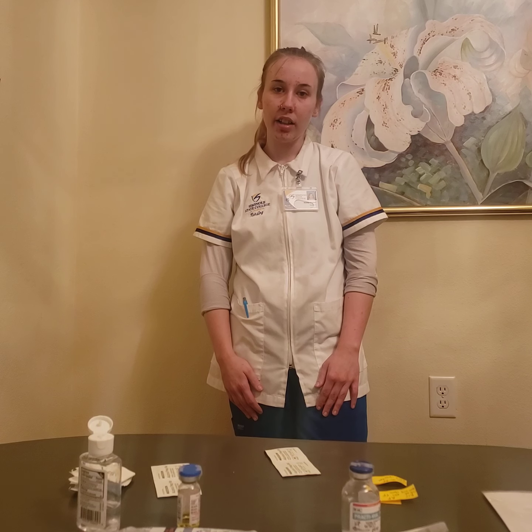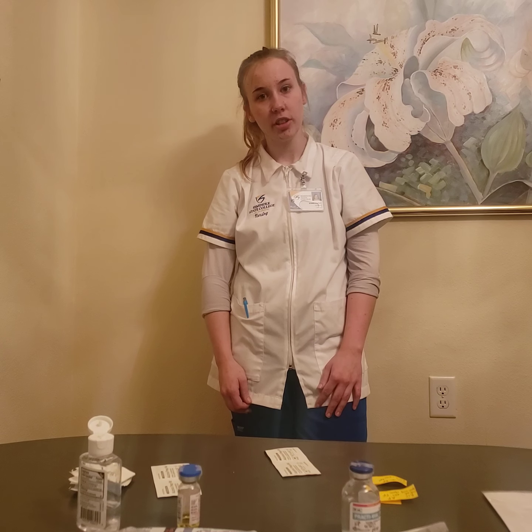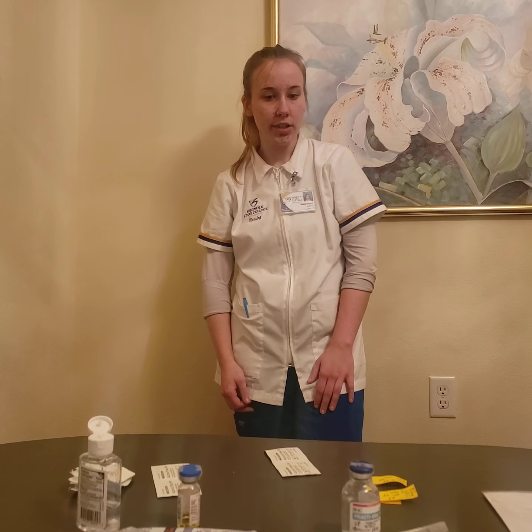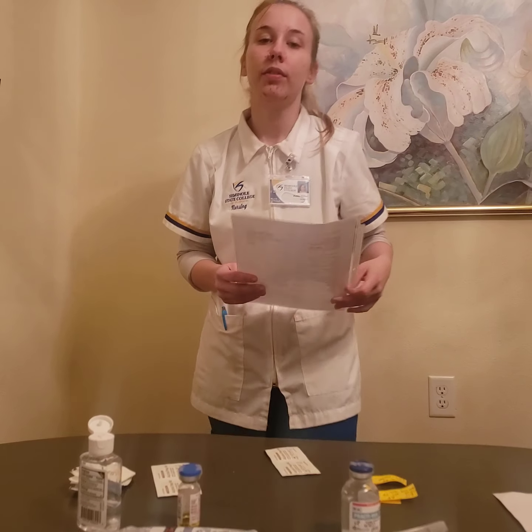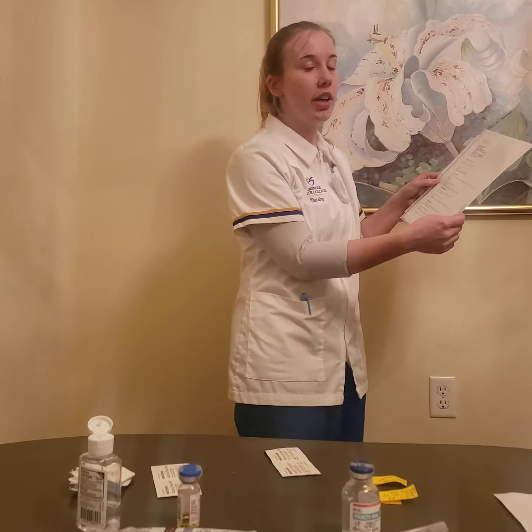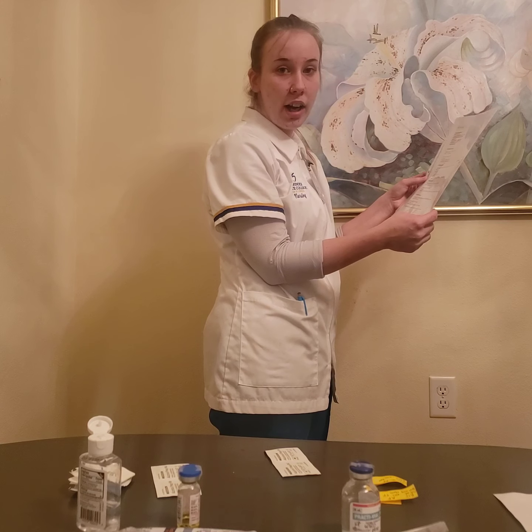I'm going to be doing my injection video for my subcutaneous injection and my intramuscular injection skill checkoffs. So I'm going to go ahead and get started. I'm going to start outside of my patient's room, and I'm going to be reviewing my patient's chart and the electronic health record. I'm going to be looking at her name, date of birth, and her allergies.